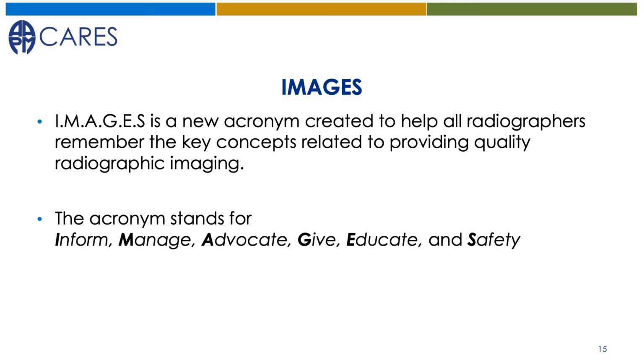Images. Since we create images as radiographers, it seemed reasonable to choose this acronym using the word images to assist radiographers in remembering the key concepts related to providing quality care to patients while optimizing image quality. The letters in the IMAGES acronym stand for inform, manage, advocate, give, educate, safety. These 6 concepts are part of every encounter with every patient during the imaging process.